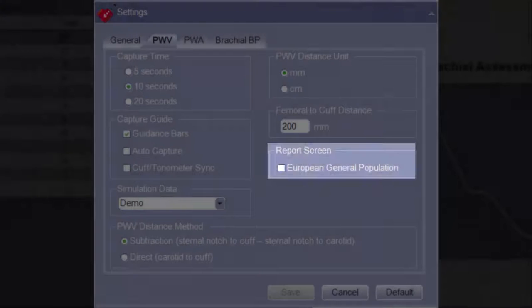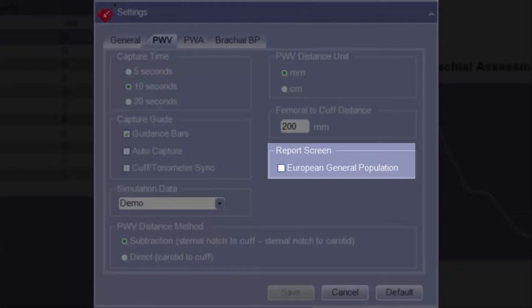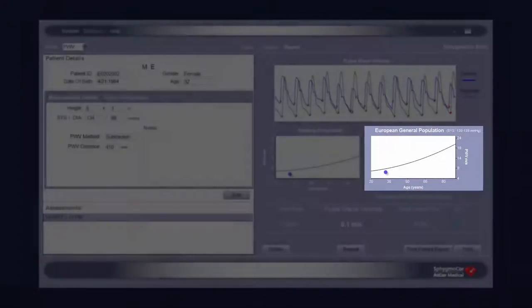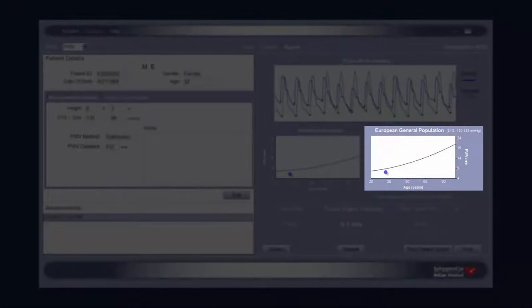Under Report Screen, the European General Population option can be enabled or disabled. When enabled, a pulse wave velocity assessment that has both an entered height and brachial blood pressure will display a graph on the report screen comparing the patient's results to the European General Population.